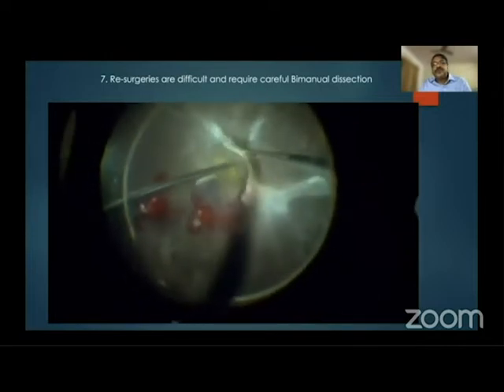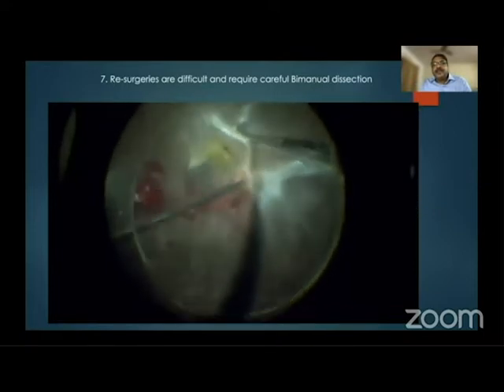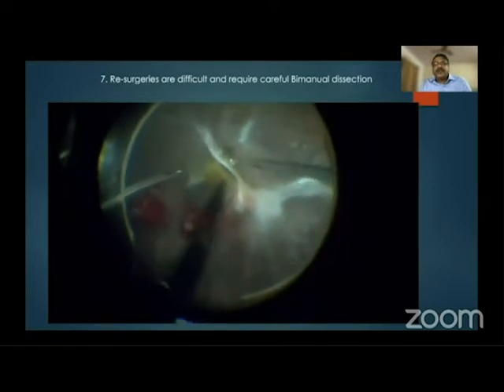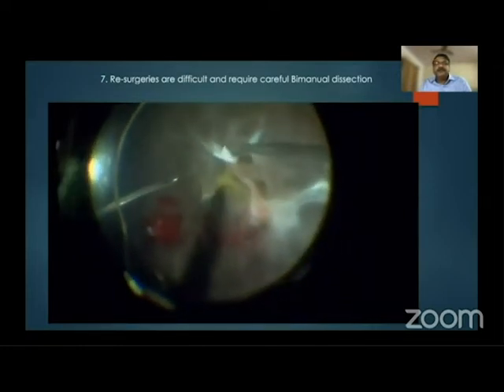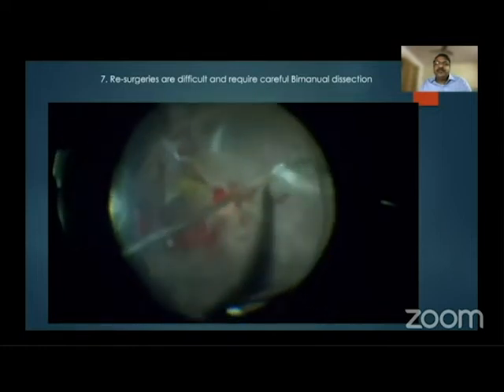One has to be very gentle with these membranes because with any additional traction, the retina would just tear along and then it would be inoperable. I remove all the cleared membranes.